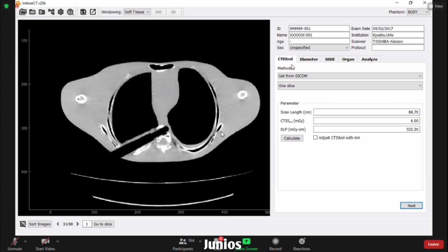And from Mr. Hantoro, how thick was each slice? Slice thickness depends on the CT technology. In the previous technology, the slice thickness was maybe 5 millimeters to 10 millimeters. However, with recent technologies, after the introduction of multi-slice CT, the slice thickness has become smaller and smaller. Now the slice thickness is less than 1 millimeter, so the resolution in the Z-axis is very nice now.